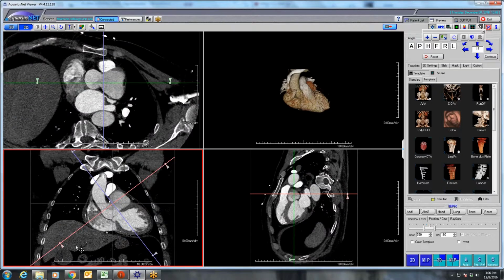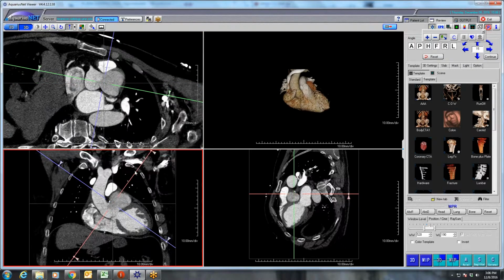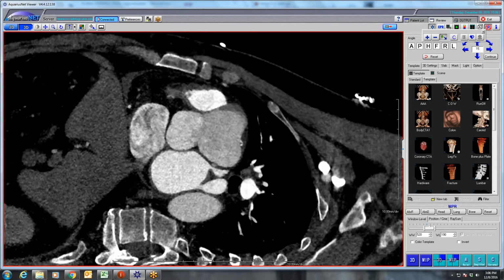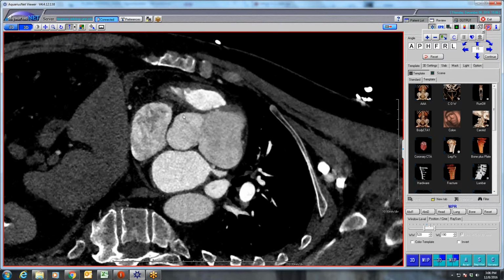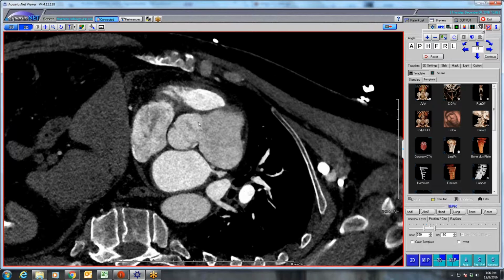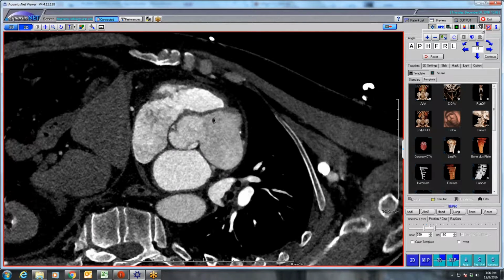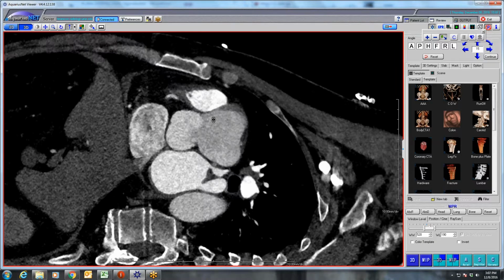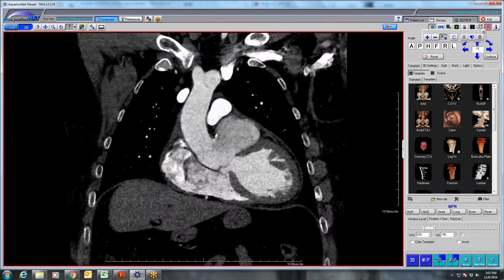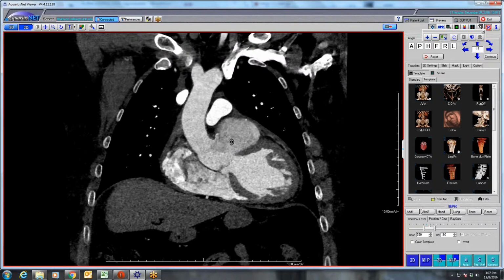It arises from the ascending aorta in the region of the left sinus. So here's kind of our valve shot. It's a bicuspid valve. Here's the non-coronary sinus, the right sinus here, and then this big thing arising in the expected location of the left sinus. So there's no communication with the LV in the sense of between this aneurysm and the LV, but the LV obviously dumps into the aorta, which then dumps into this large aneurysm. Got it.